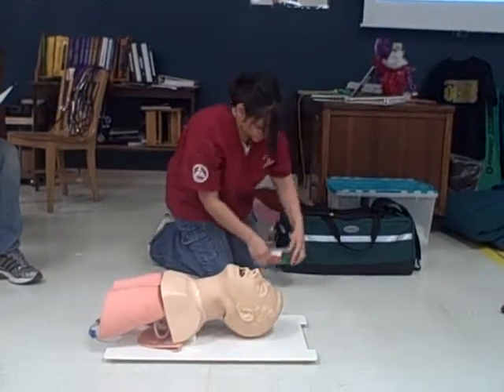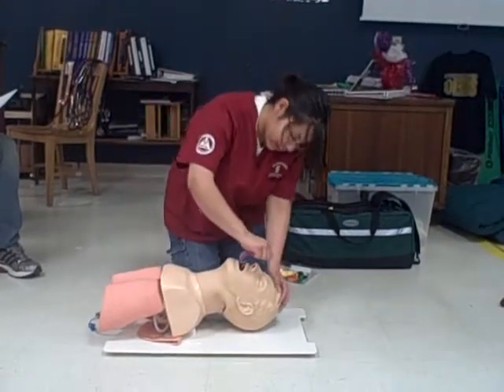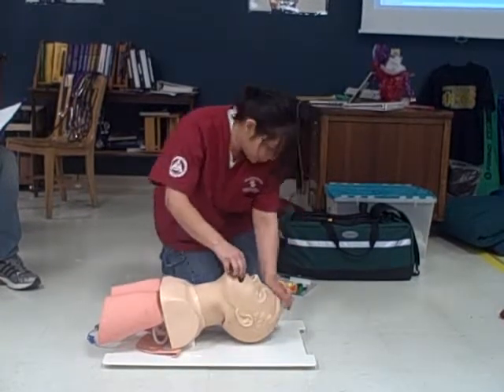I'm sizing an oral airway. I'll measure it from the ear to the corner of the mouth. Place it in, and once I get to the soft palate, I'll do a 180-degree turn and place it in.